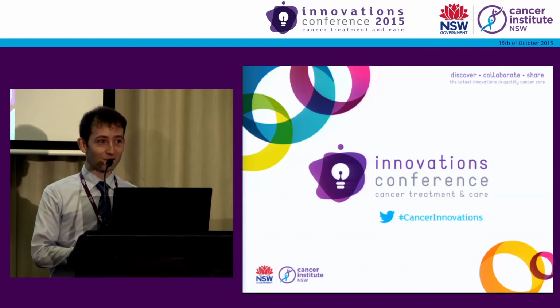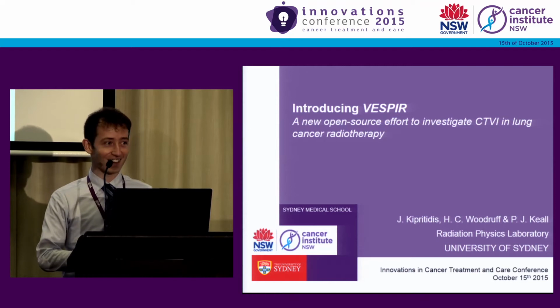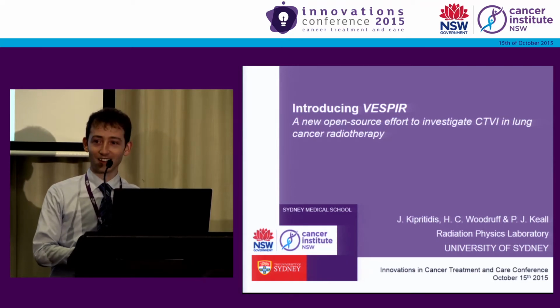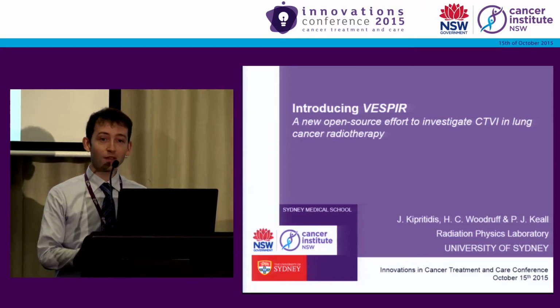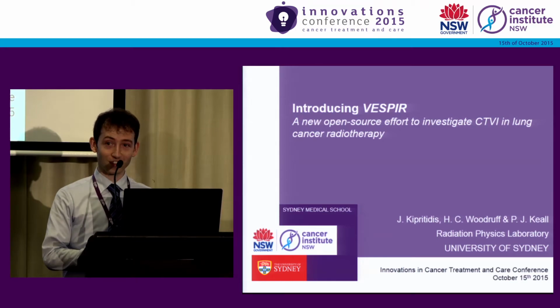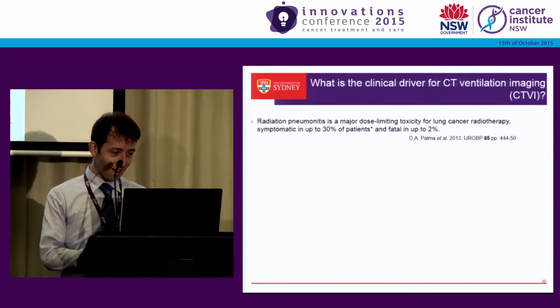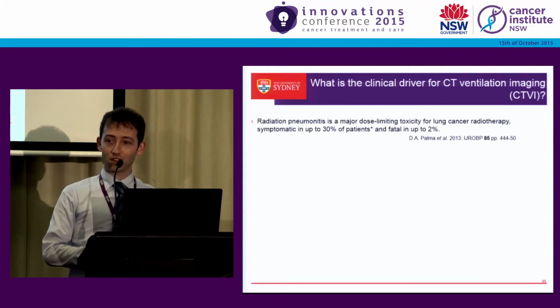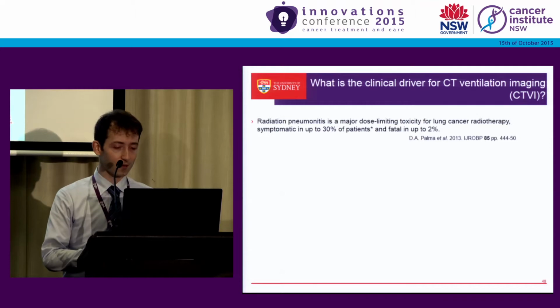So this talk is about software, but I realize software in and of itself isn't that exciting. What I hope you will find exciting is that we are developing a tool that you can download today, which will enable you to explore an entirely new functional lung imaging modality called CT ventilation imaging. So why are we interested in CT ventilation imaging in the radiotherapy space?